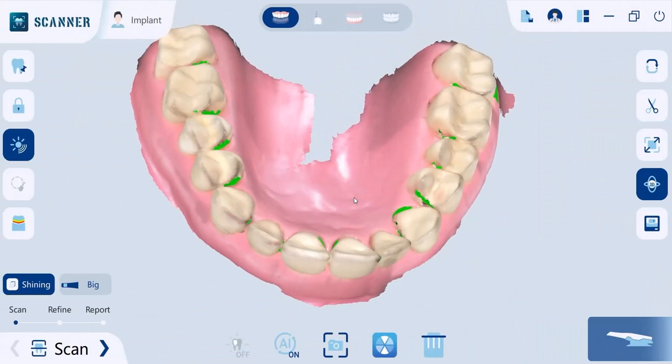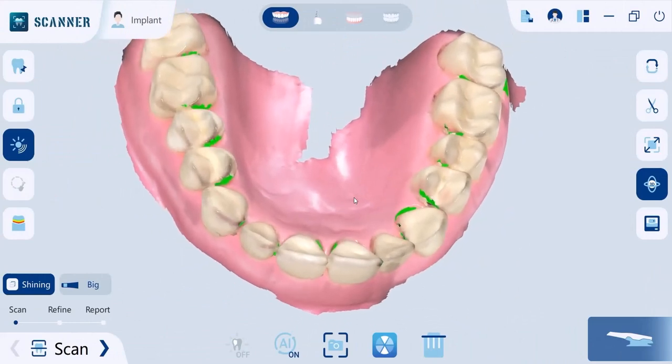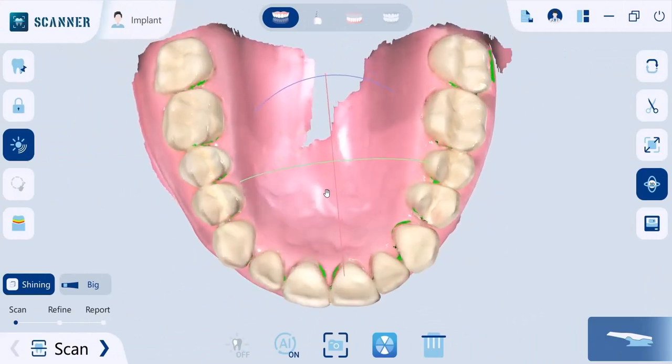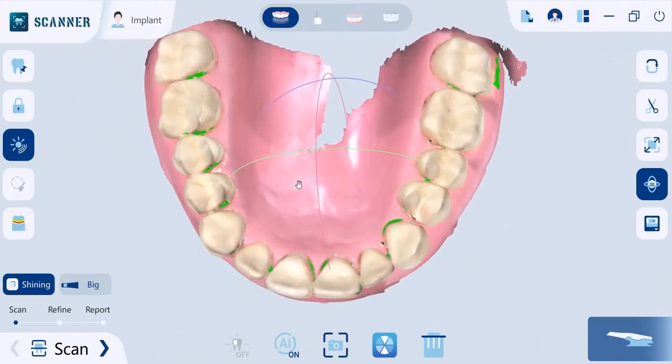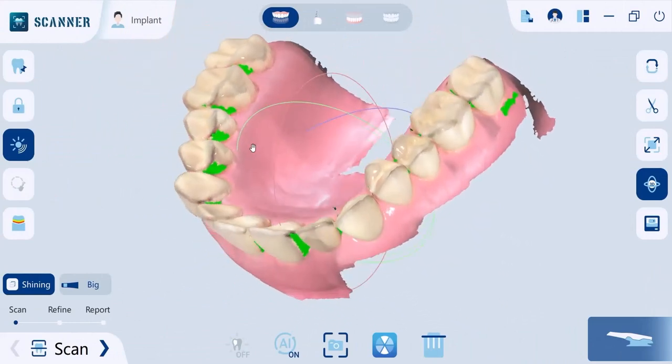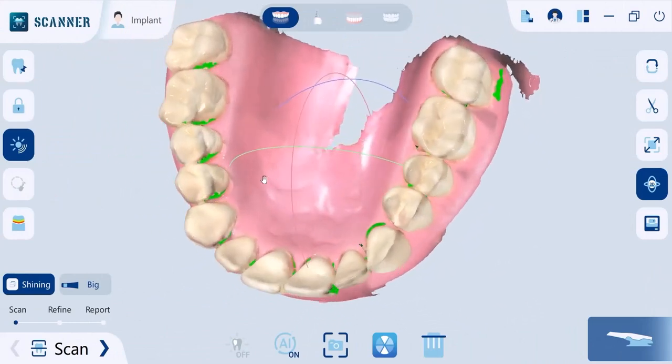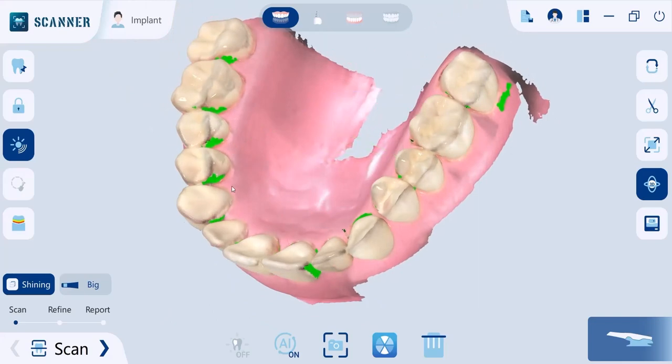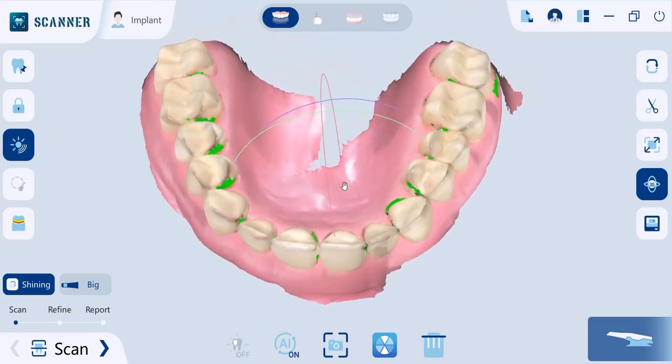Also, as you can see, there are hole highlights on models shown in green to indicate areas that need further scanning. Small holes are automatically filled.